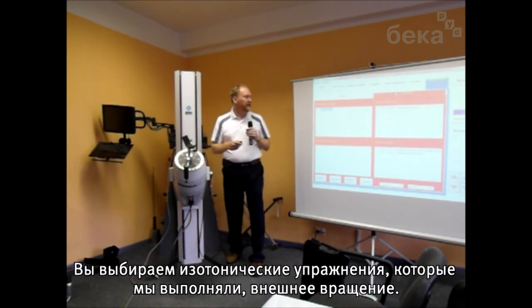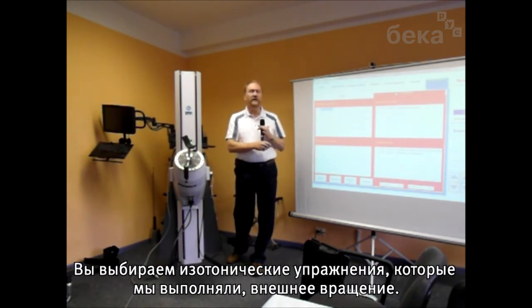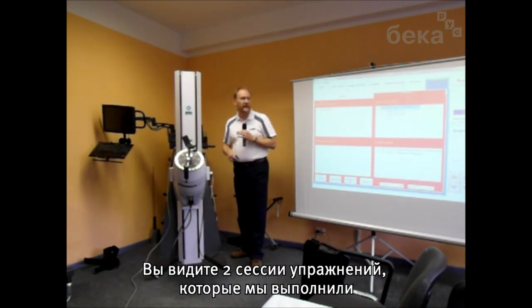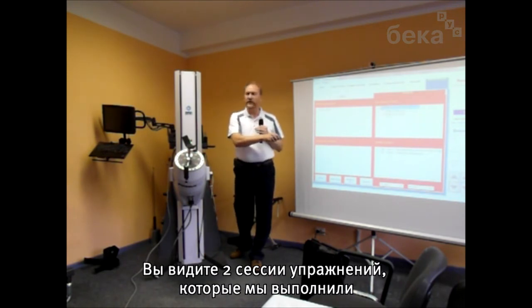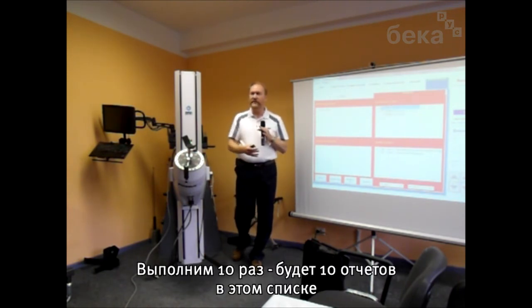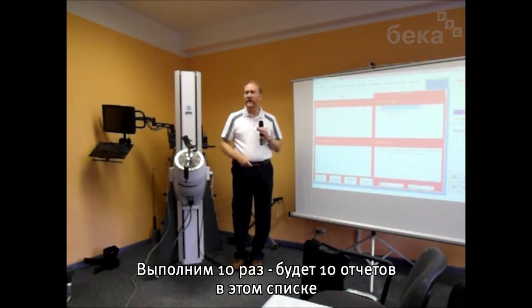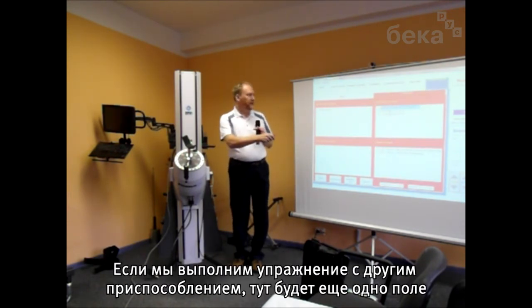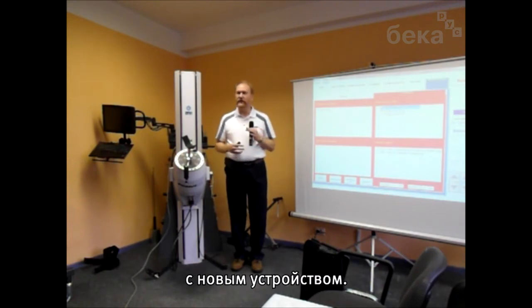So if we're looking at the isotonic exercise that we did, 701 external rotation, if I select that, you can see the 2 exercise sessions that we just finished. If we've done this 10 times, there would be 10 items listed under that tool number. If we've done more than one tool, that would also be a separate line item in that window there to choose from.